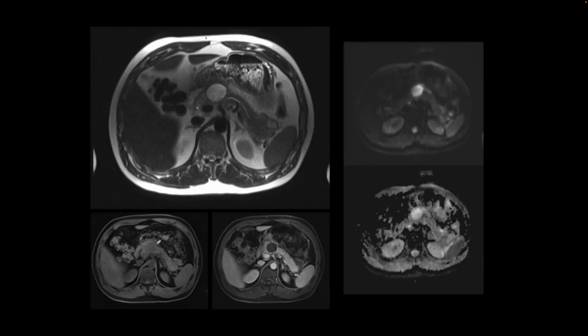This is our next patient. They were admitted for acute pancreatitis, and we evaluated them with an MRI of the abdomen. On the top left is an axial T2 weighted image showing the pancreas and the pancreatic duct inside. There is some swelling, maybe some fat stranding, and there is this focus of T2 hyperintensity, a cystic focus, which shows some peripheral enhancement, no internal enhancement, and no restricted diffusion. And so a finding like this would be consistent with an acute necrotic collection in the appropriate clinical setting.